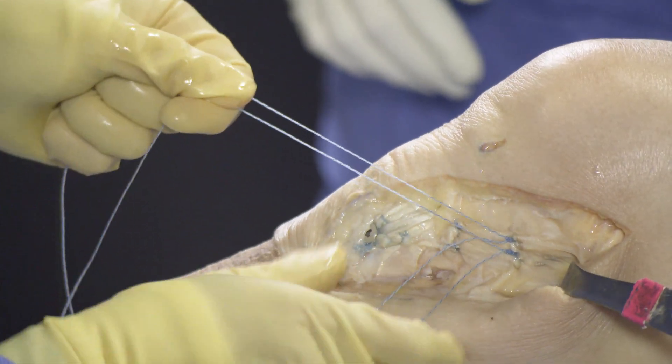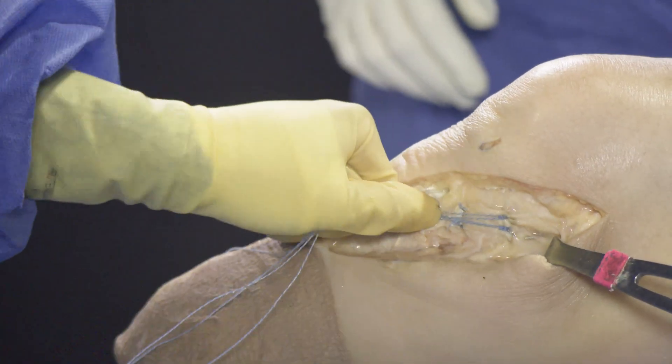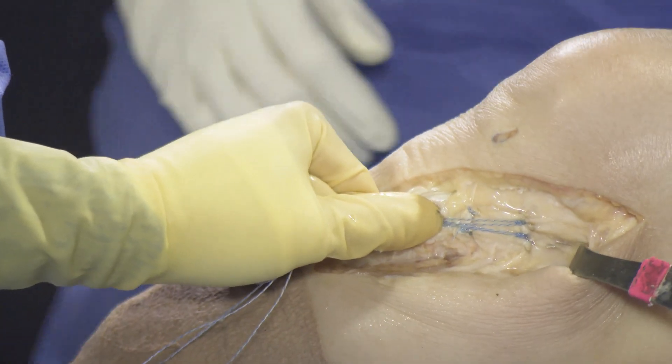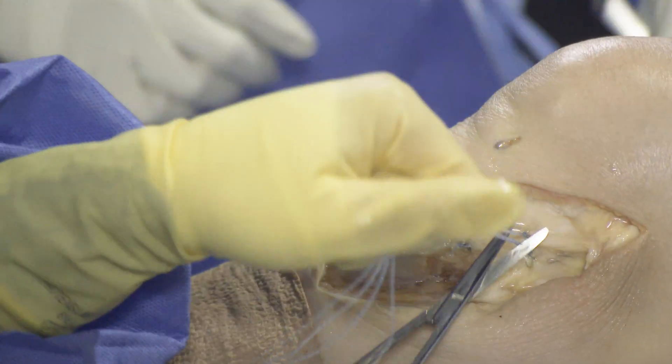Another option is to use the suture ends from the proximal anchors to your choice of additional anchors to secure the distal row in a brace-like or lateral row configuration.